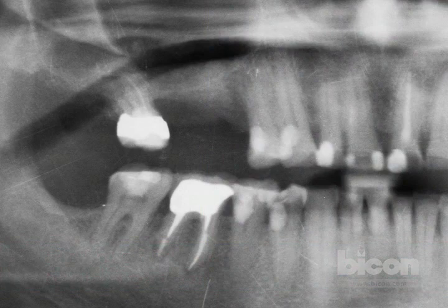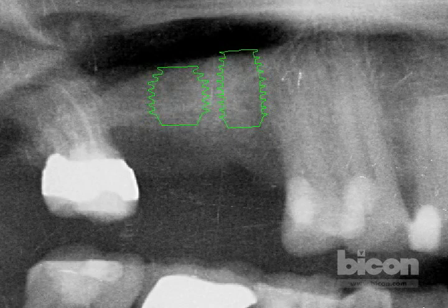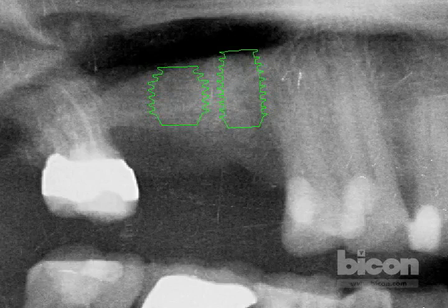Our young patient is missing teeth 15 and 16, which are numbers three and four. The area of number four has been grafted by a previous dentist, and we're assuming the graft material was either autogenous or banked bone. On the radiograph, you can see a 6 by 5.7 millimeter implant template that is barely fitting within the confines of the available native bone.